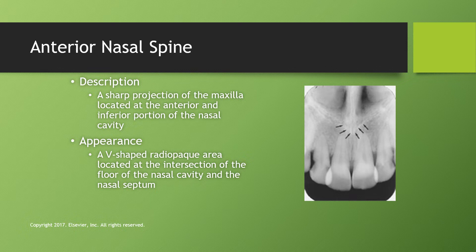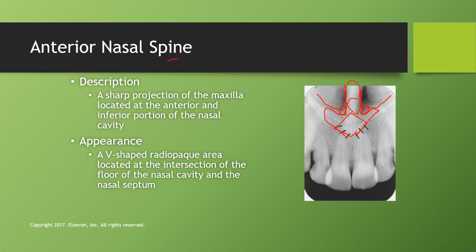The anterior nasal spine is called a spine because it is a thorn-like projection — specifically, a sharp projection of the maxilla at the anterior and inferior portion of the nasal cavity. It looks like a duck foot. The two small radiolucent areas between the feet of the duck are the superior foramina of the incisive canal, and above this you can see the nasal fossa. The nasal septum runs through the center. The anterior nasal spine appears as a V-shaped radiopaque area at the intersection of the floor of the nasal cavity and the nasal septum.